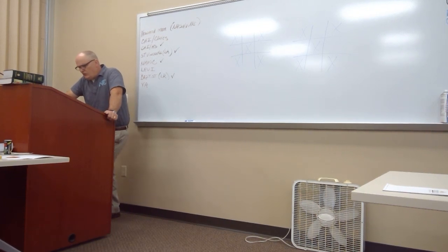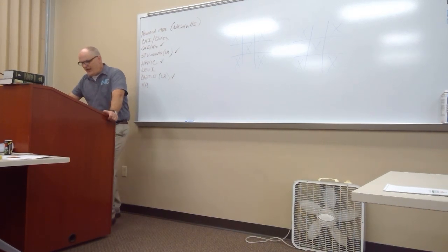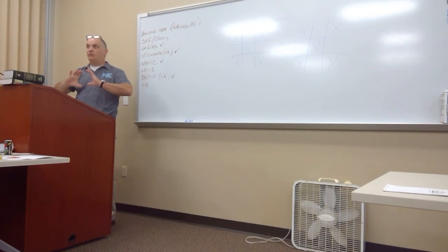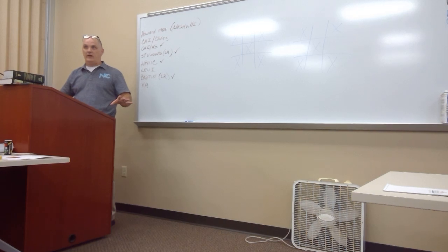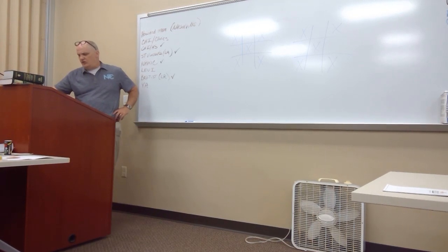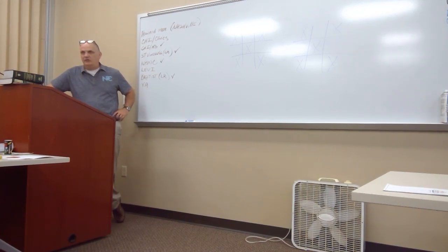Figure 9, TAC 11 over on page 189. Now you've got, do you see how all those segs are clumped together? If you're doing a diff on that, you've got to count all of them, all right? So it's not going to be a perfect scenario like when you did diffs and all your cells are evenly distributed, okay? You've got to count the cells you see because they went through that process. So in that picture, it's trying to show you the difference. You've got a little bit of intracellular bacteria in there, and then you've also got some extracellular bacteria in that picture as well. That means bacteria outside the cells.